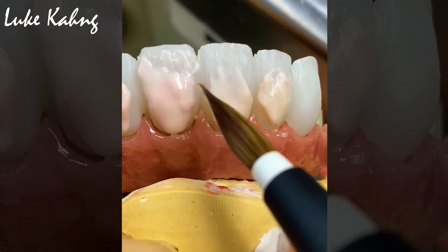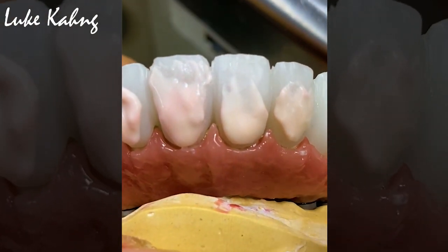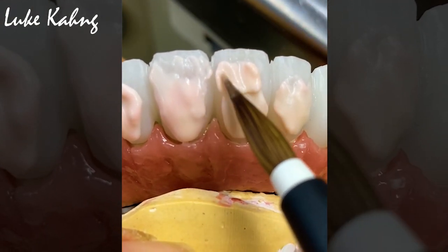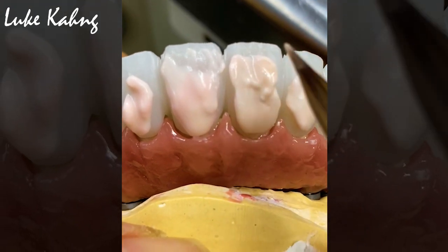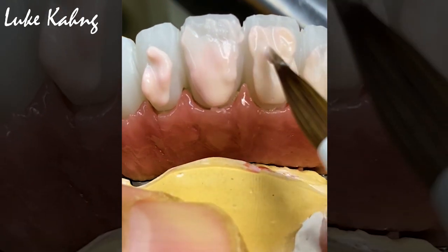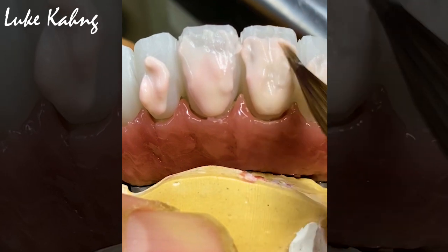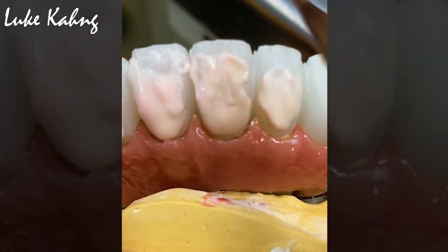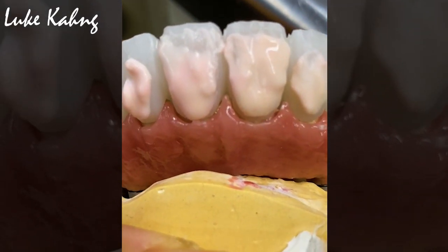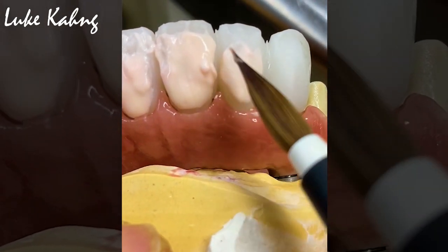Between tooth, I'm going to recreate the shape — especially in the gingiva area. Now I keep on applying the B1. See this contour — so I make it a little bit more like this. The lingual side — I need to go in this direction.